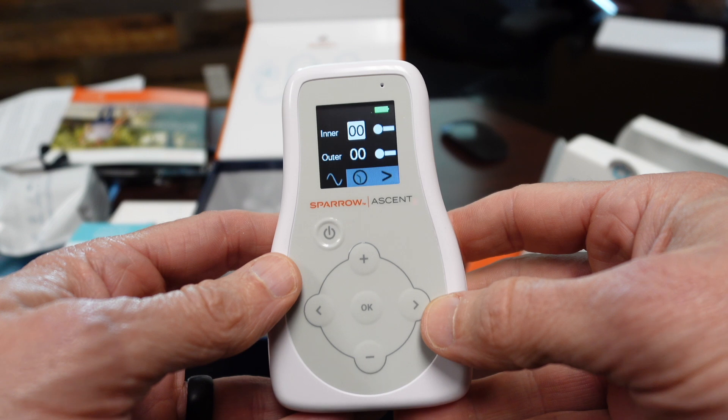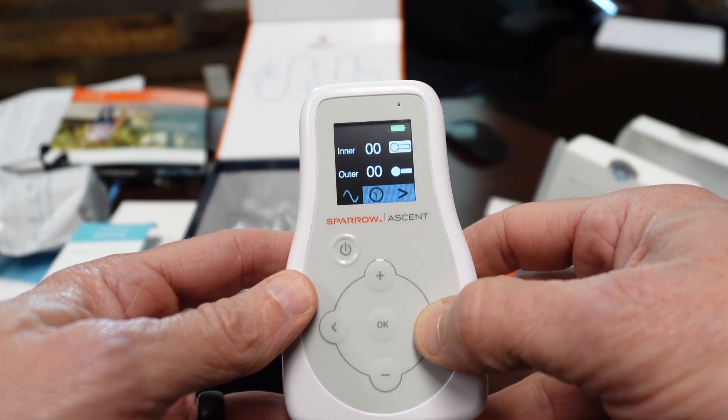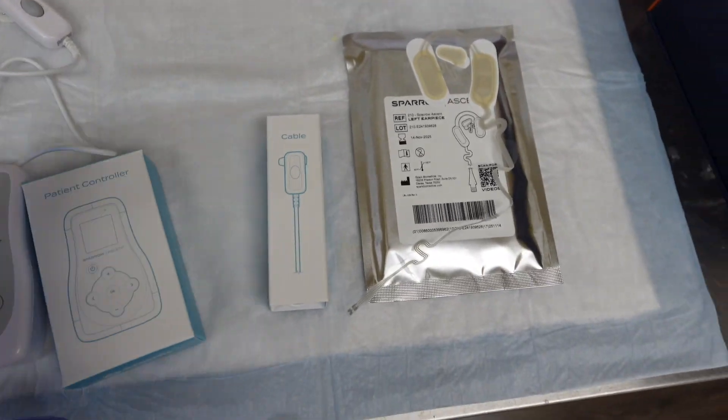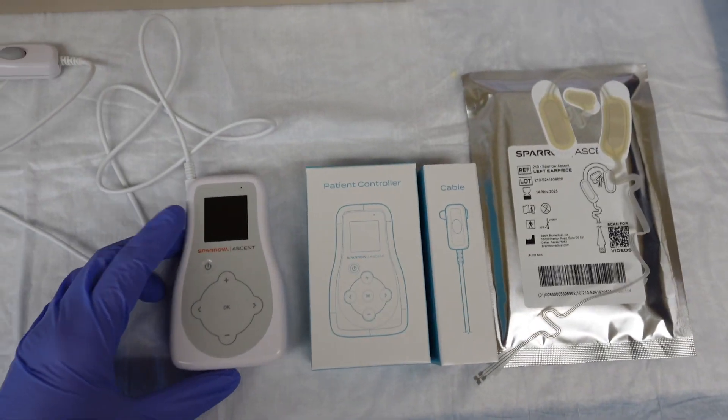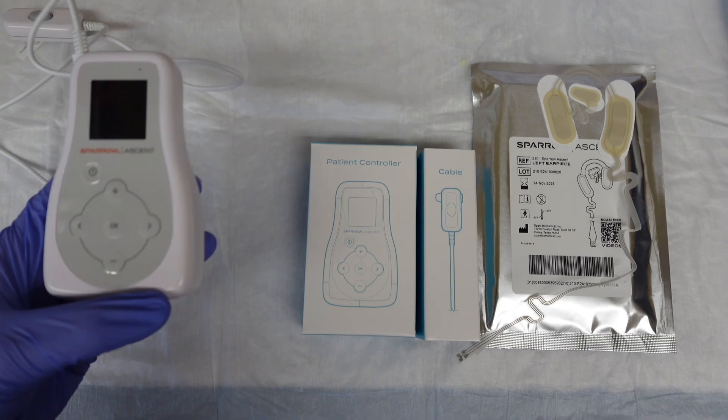This is what the device looks like — it's small, pocket size. You can put it in your pocket, and it actually comes with a belt loop you can clip to your belt. There's an inner and an outer electrode. You can adjust them separately.